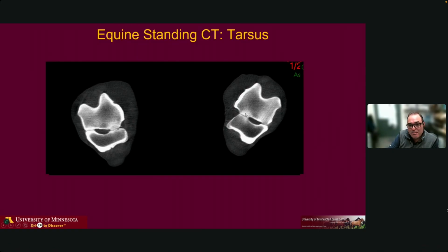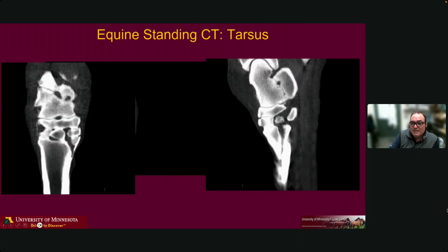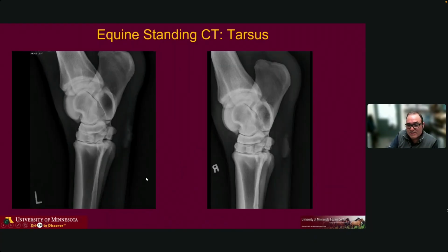Comparing with the other side, you can see how significant these changes are on this medial facet of the talocalcaneal joint. So when you go back and look at the other images of the CT, you can see right here how it basically had a cyst-like lesion affecting that area. And going back to the x-rays, these were the original x-rays, the only thing that would make you suspicious would be the changes at this level, but there's no hint of a cyst-like lesion or anything like that. So the CT provided quite an accurate diagnosis there.